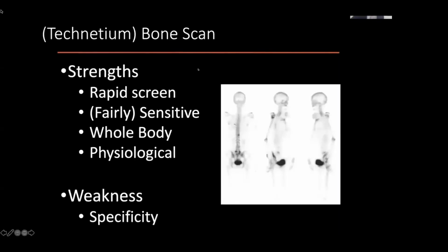Really quickly, nuclear medicine. Nuclear medicine is kind of the opposite of other radiologic evaluations. With the X-ray or CT scan, you take radiation from the outside, it goes through the patient and you measure what's left. With nuclear medicine, the patient gets injected with a tracer, which contains the radiation and which is linked to a particular physiologic process. That then gets detected. So the radiation comes from inside the patient out and gets measured by detectors.